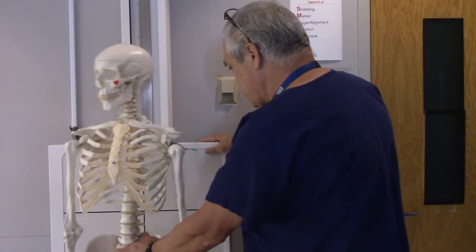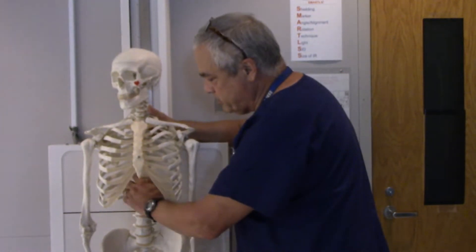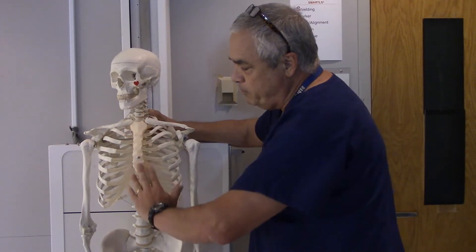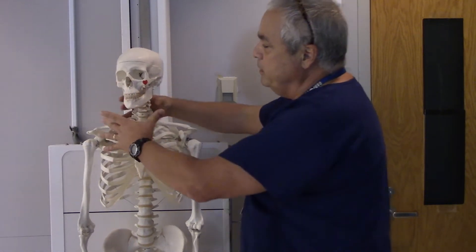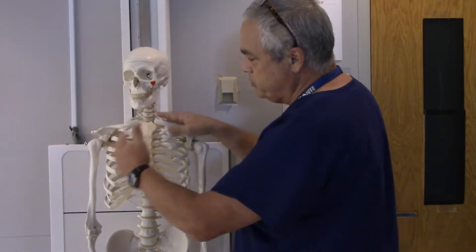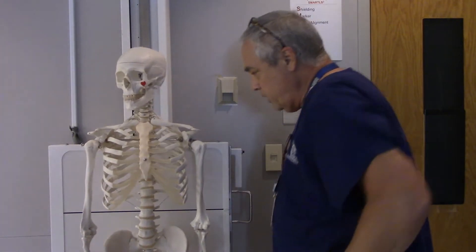Centering as usual along the midline — with Boney here that's easy, I can see his spine. If I can't see the spine, I can palpate for the sternum or find the jugular notch. If I can't palpate anything, I can at least see the neck and aim for the center of the patient's neck to get my midline. I want to make sure they're not rotated one way or the other.